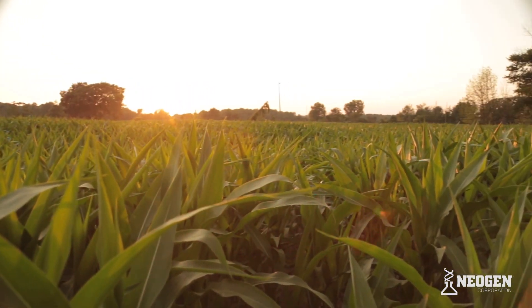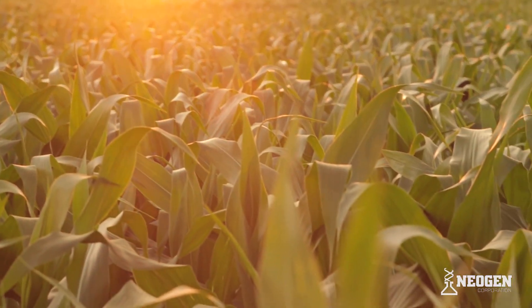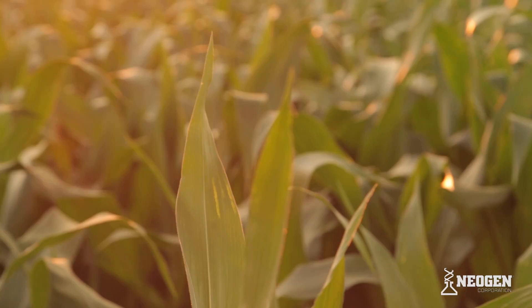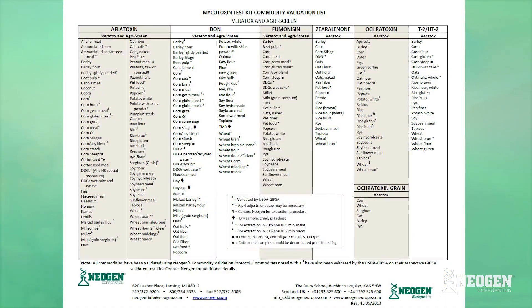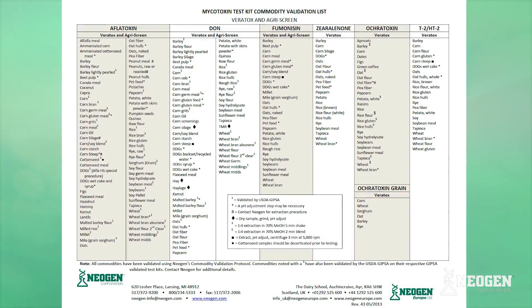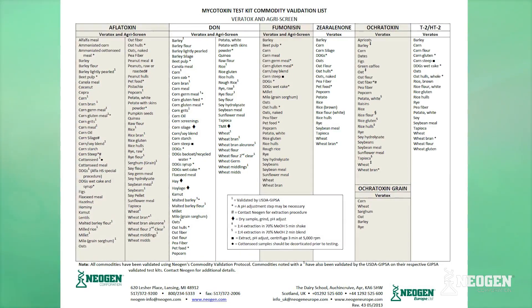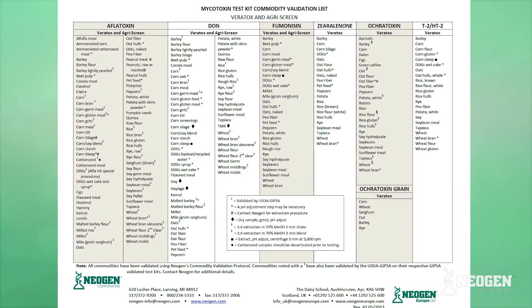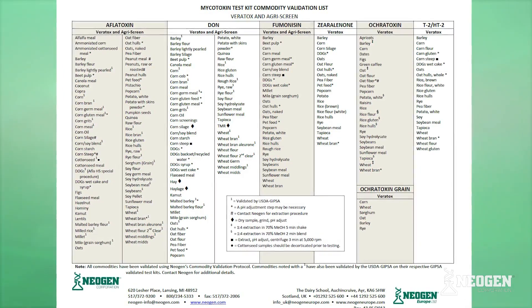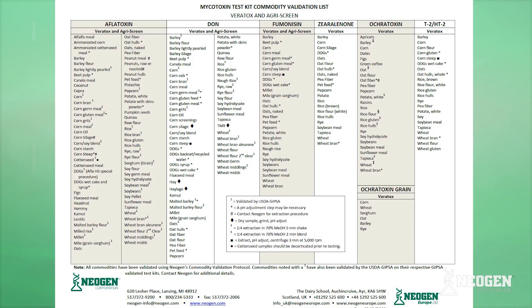This video will demonstrate the extraction of corn, as it is the most common commodity tested. Various commodities have been validated on the test kits, while most utilize this common extraction. If you have questions about a particular commodity, please refer to validated commodities in the kit insert or contact your sales rep for the most current validated commodities list.